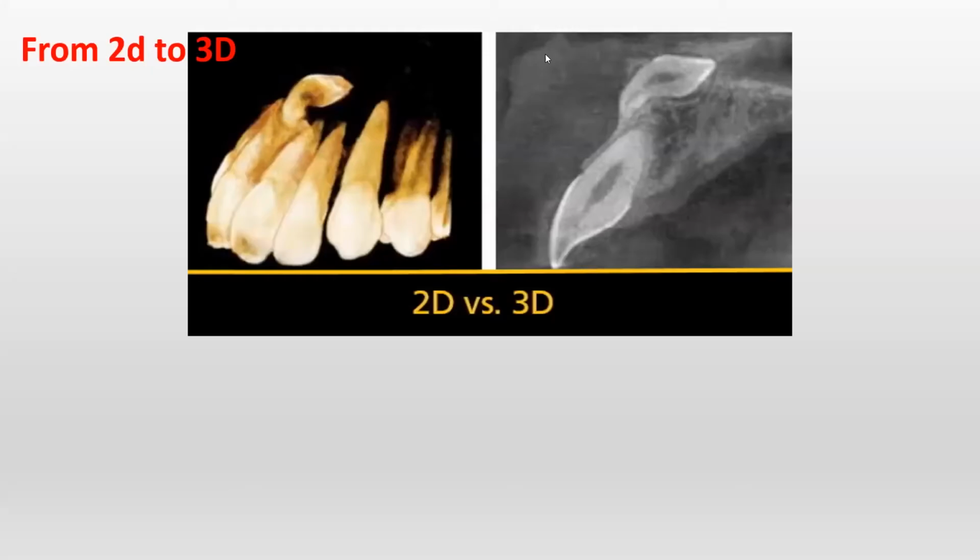This transition from 2D to 3D has really revolutionized the field of dentistry, providing dental professionals with enhanced diagnostic capabilities and more precise treatment options. As we all know, the most commonly used 2D imaging would be the IOPAs and the panoramic X-rays. They allow us to visualize the individual teeth, surrounding bone, as well as the oral cavity.